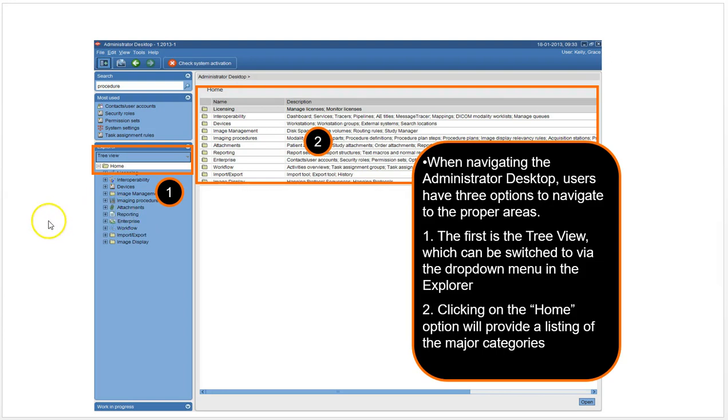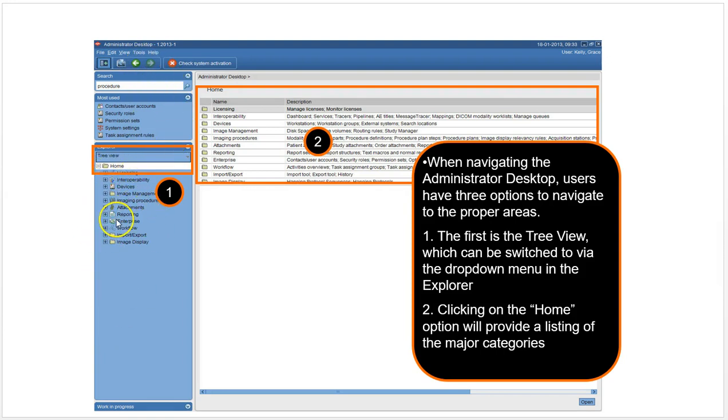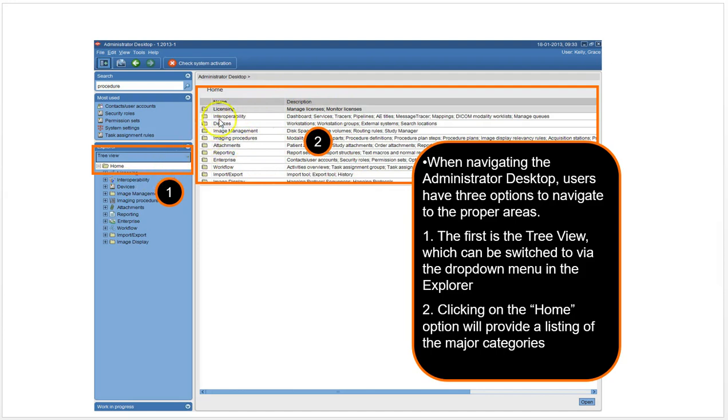If you are interested in what devices are connected to the PACS, you might want to go under devices. So tree view in the navigator for admins, and you have basically all of the same choices—interoperability, devices, image management—just here where you can just in a folder view where you can just click on the folder and then go under the folder.